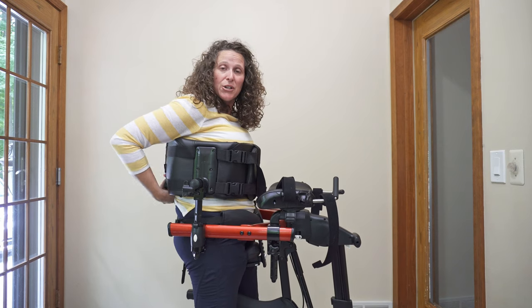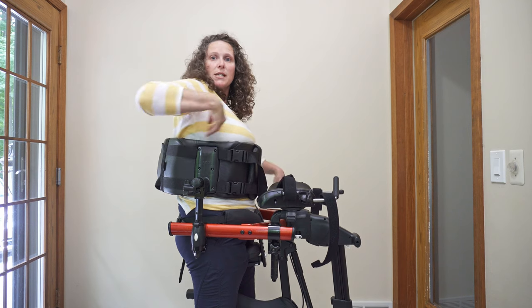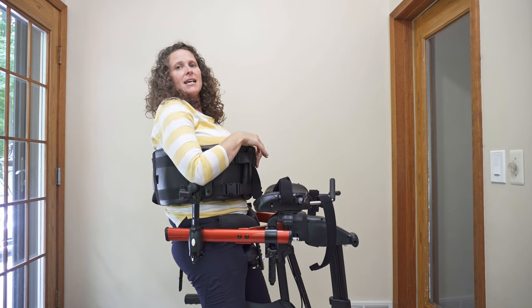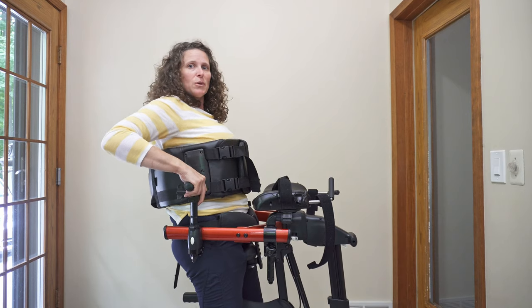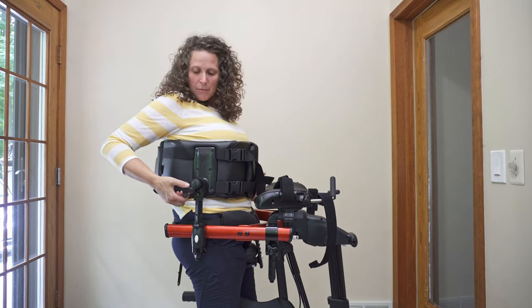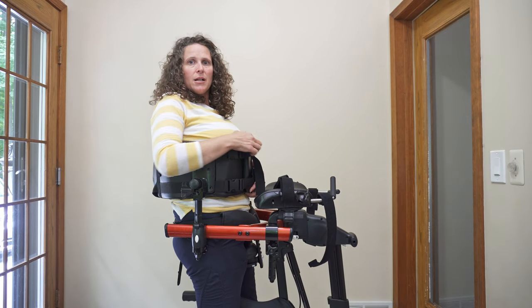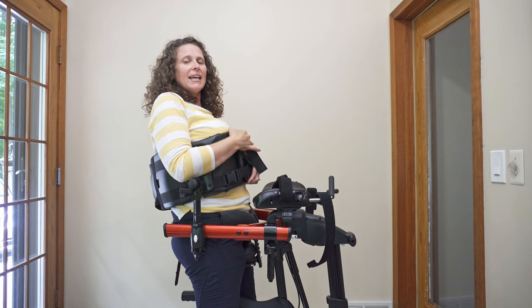Make the back of the chest prompt really loose — what that does is it allows the person to drop back. The angle can also be changed by turning these knobs right here, so as I open up the back I can actually tilt this chest prompt up.